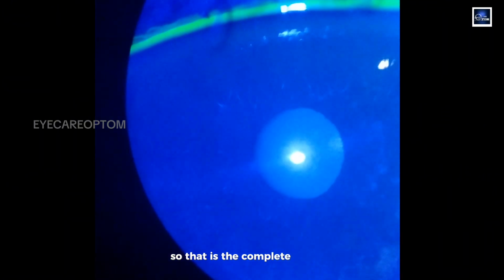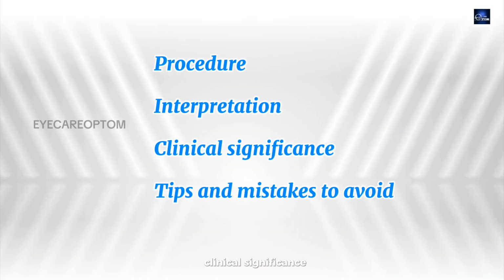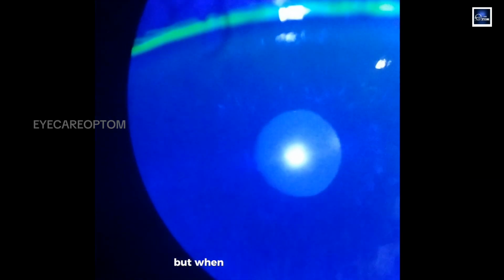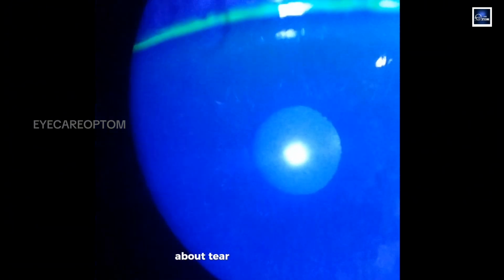So that is the complete guide to invasive tear breakup time: the procedure, interpretation, clinical significance, and the tips you need for accurate, reliable results. TBUT is a simple test, but when performed correctly, it gives us extremely valuable information about tear film health and dry eyes.